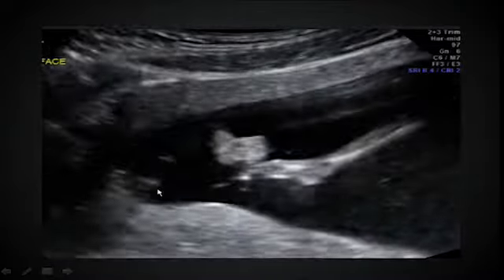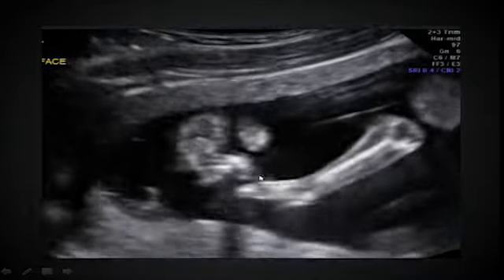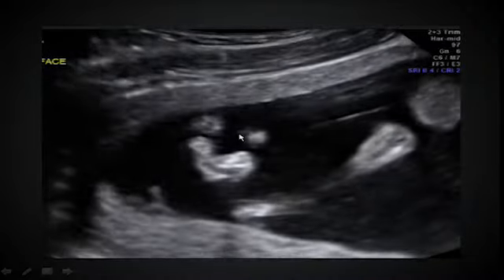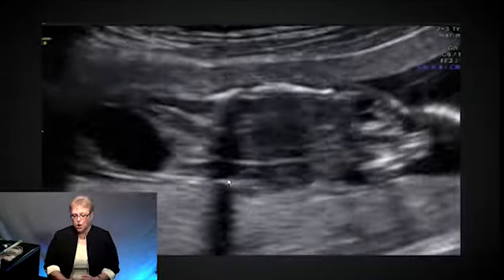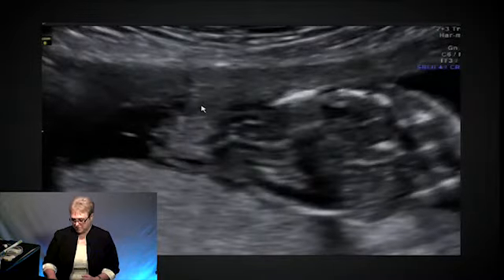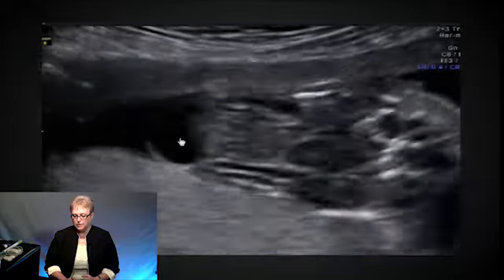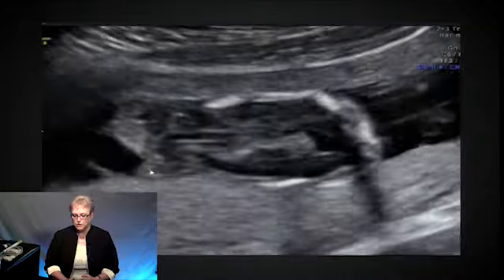Hand again. So you can see how that comes in. There's a distortion from the maxilla up through the orbit, through the middle of the head, and then over towards the side. Now looking at a cross section of the head. This is the back of the head. This is the cerebellum hanging out back here. So left, right, anterior, posterior.